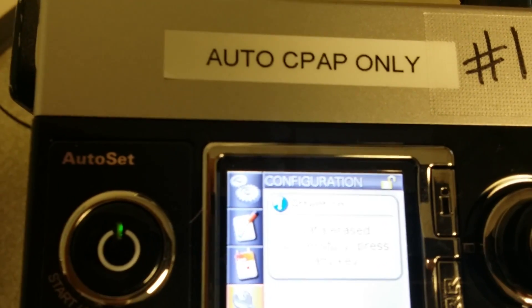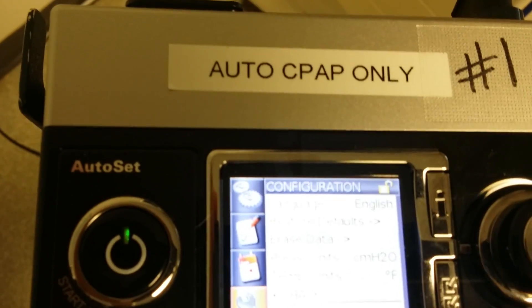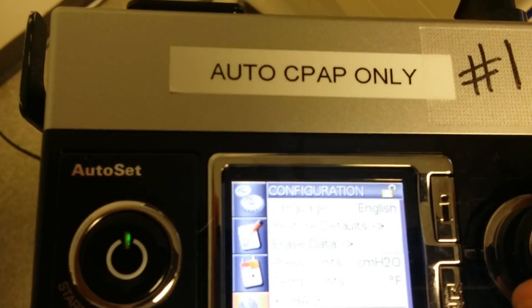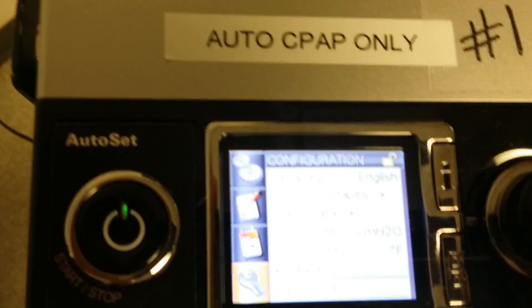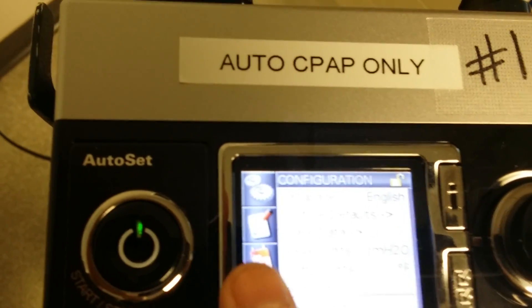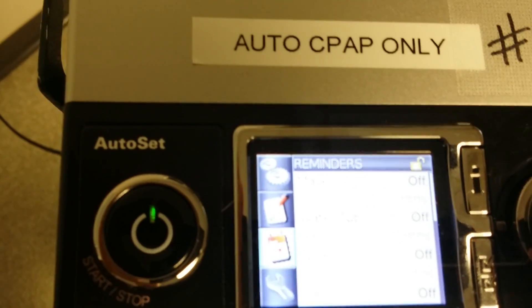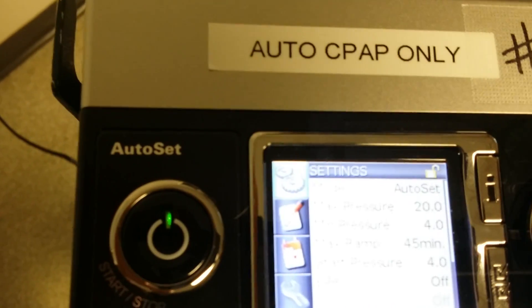Now it says the data was erased successfully — hit any key. Now use the same menu and go down to back to get back to the choices. Go from this side over to this side, then scroll up until you see settings at the top.